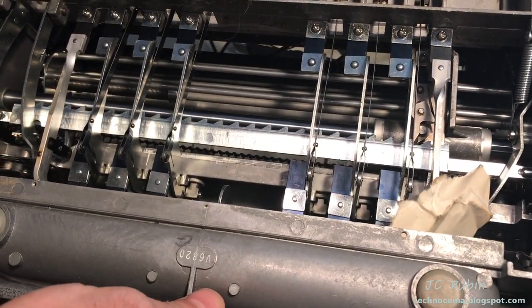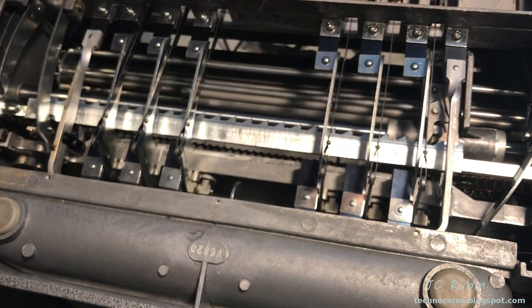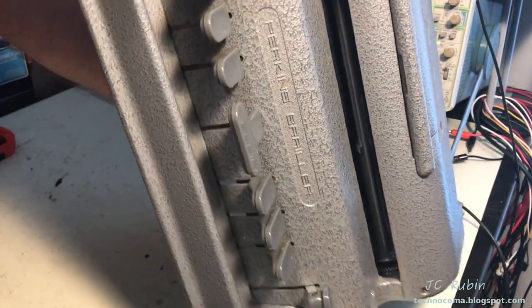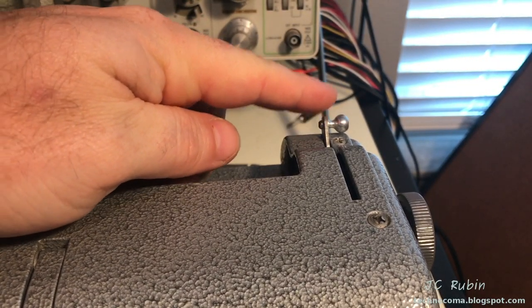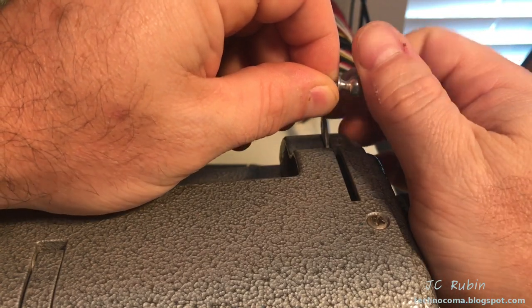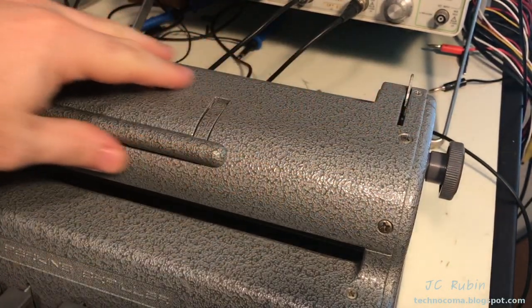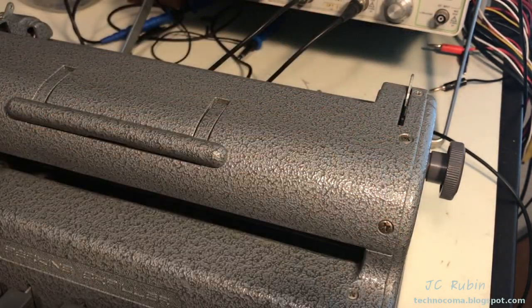Right away I can see a piece of paper stuck in here — probably nothing terrible, but stuff like this can bind up a unit, so I'm pulling that out. Now turning it back over, I'm going to remove the paper feed knobs found on both sides of the machine. As I remove each one, I put the screw back in so parts don't get lost.